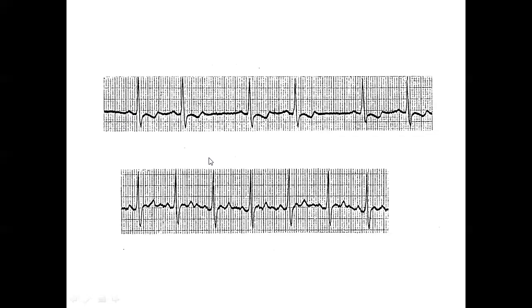Then later, the same patient became regular. When it becomes regular, I lined up this with this one. Which one lines up with this one? It's this one. We are dealing with a Wenckebach phenomenon from the sinus node to the atrium. So SA block, not AV block.